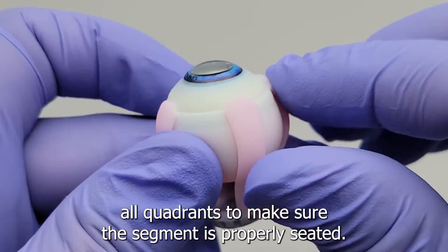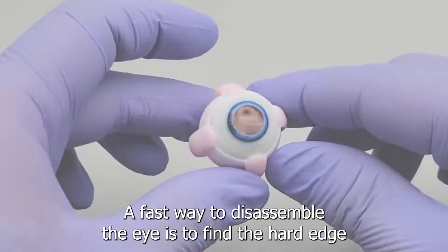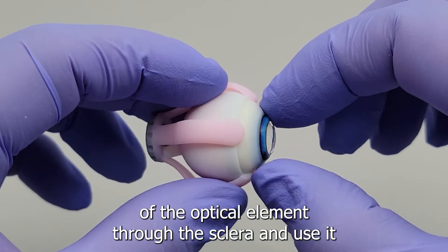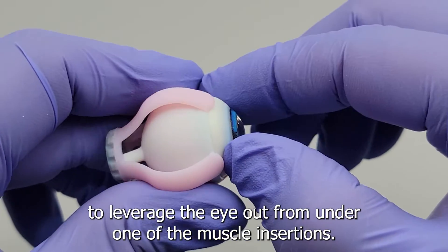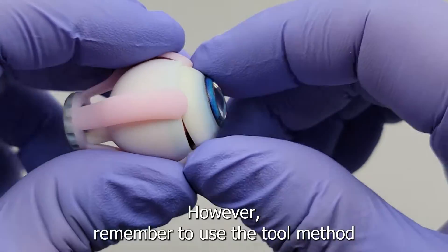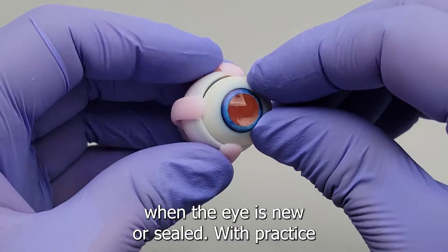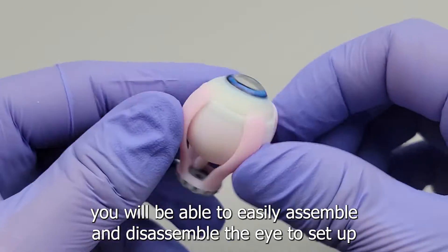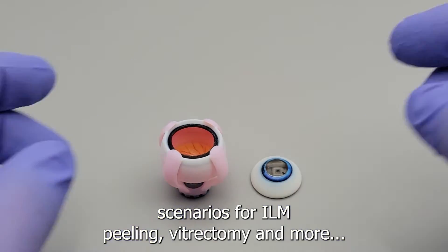Lastly, compress all quadrants to make sure the segment is properly seated. A fast way to disassemble the eye is to find the hard edge of the optical element through the sclera and use it to leverage the eye out from under one of the muscle insertions. Remember to use the tool method when the eye is new or sealed. With practice, you will be able to easily assemble and disassemble the eye to set up scenarios for eye exam, peeling, vitrectomy, and more.